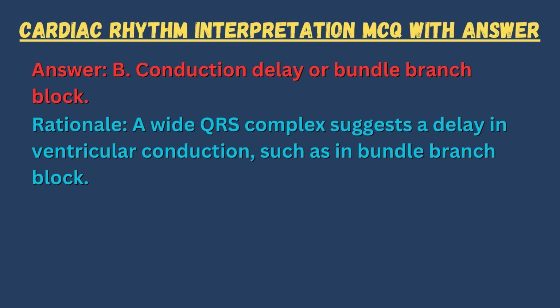Answer: B. Conduction delay or bundle branch block. Rationale: a wide QRS complex suggests a delay in ventricular conduction, such as in bundle branch block.